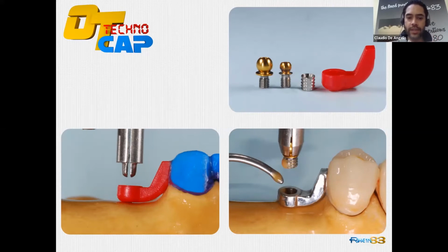But once I cast it, I'm very free to polish. I do not have the sphere here. I do not risk to damage my sphere with a bar during the polishing, during whatever I need to do as dental technician over this attachment, okay? I can produce my aesthetic part. Of course, for placing this, I have a proper parallelometer key. I have a proper parallelometer key.